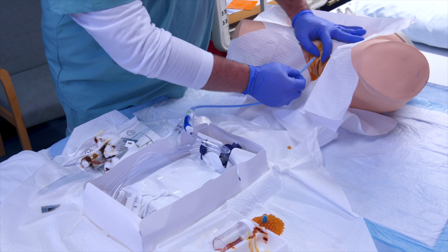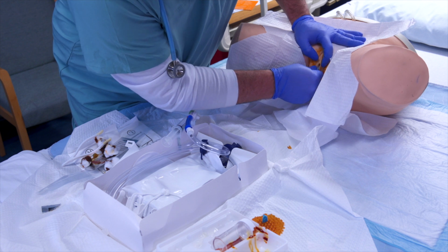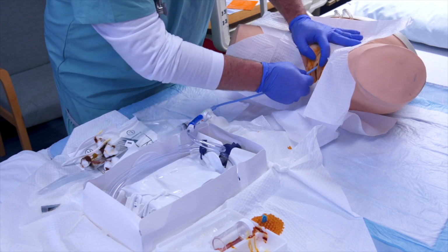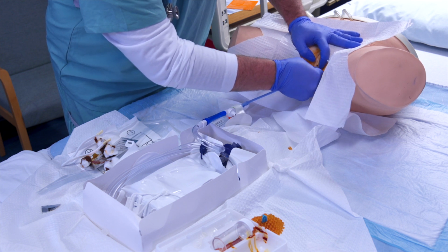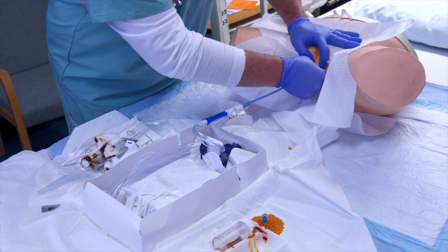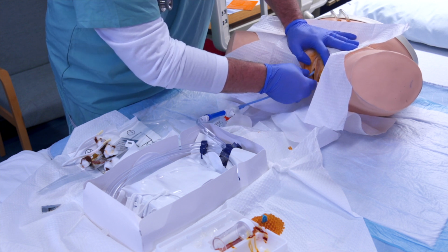With your non-sterile hand, part the labia and place the catheter tip at the meatus. Slowly insert the catheter into the meatus with a firm, continuous movement until you can see urine in the tubing. You may feel some resistance. Slowly advance the catheter another 2 to 3 inches so it is completely in the bladder.